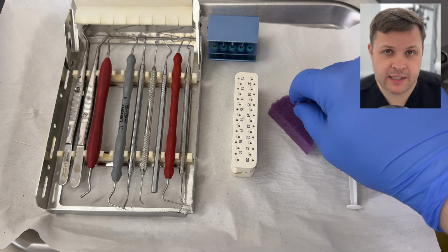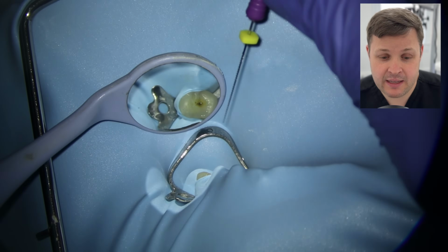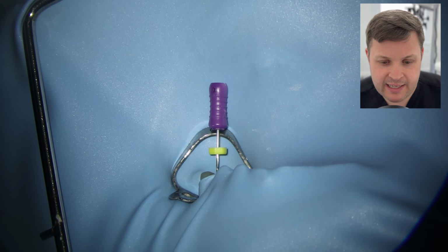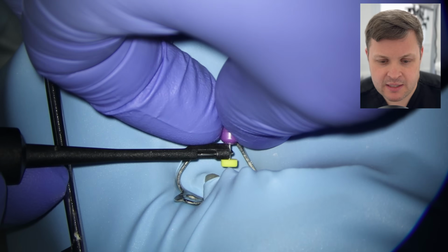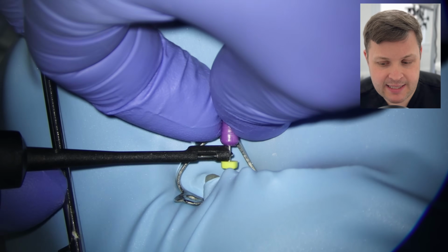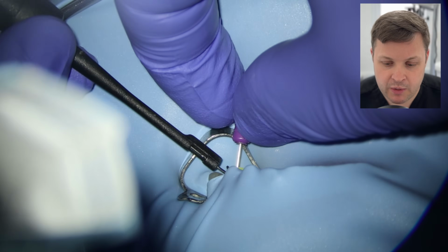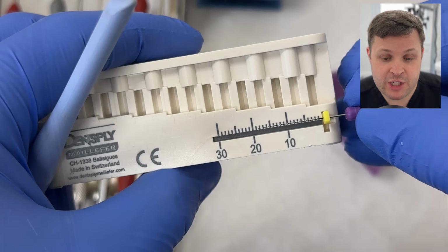Once we've filled the cavity up with irrigant, I'm going to pick up a size 10 K file, and we're going to attempt to get to 0. I have a little fiddle around with this, and I can't quite get to 0 in this case. So I'm just going to move the rubber stopper as far as I can get, and then measure that, and that's going to be our reference when we're shaping the coronal to mid-third. Again, we adjust the stopper, and the furthest point we can reach here is 19 millimeters.